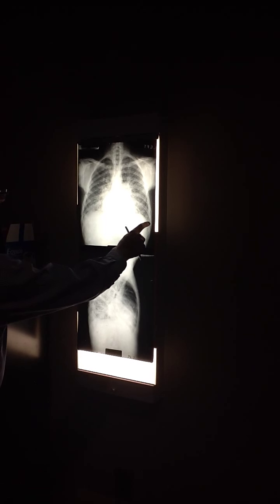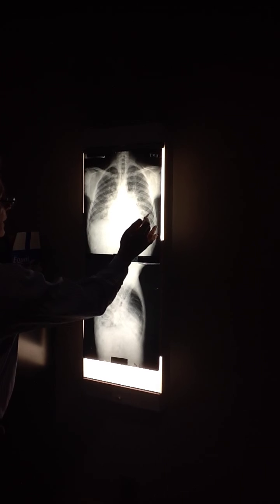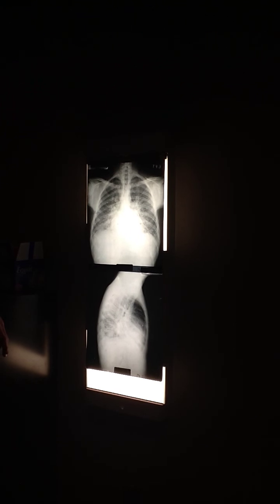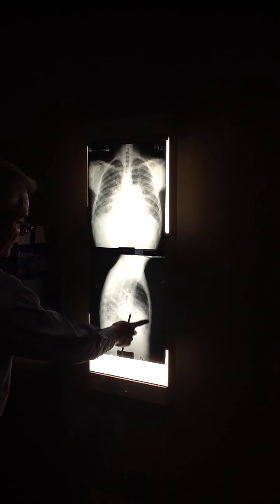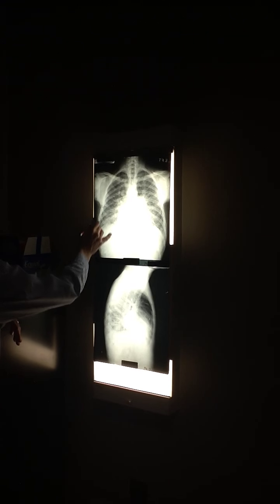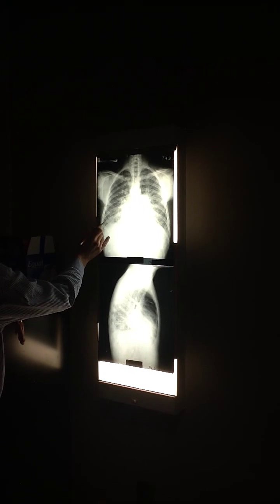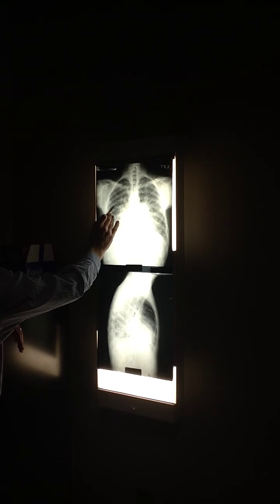Above the costophrenic angles, there's one right there. See it right there? Mm-hmm. Now, it doesn't mean they've got to have three or four dozen of them. They may only have a few of them. There's more actually behind the sternum on this example than there are above the costophrenic angles. There's one faint one right there, probably one up here. And this is an A line right there.